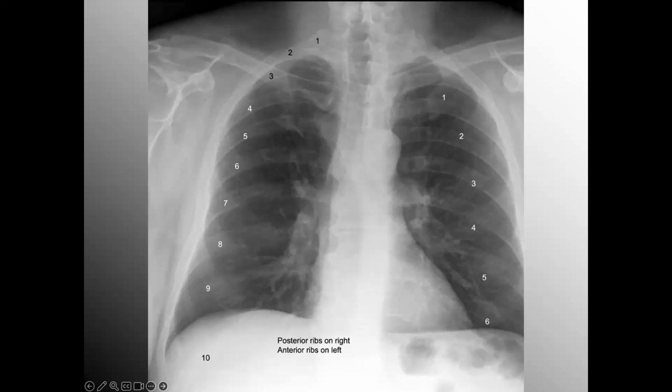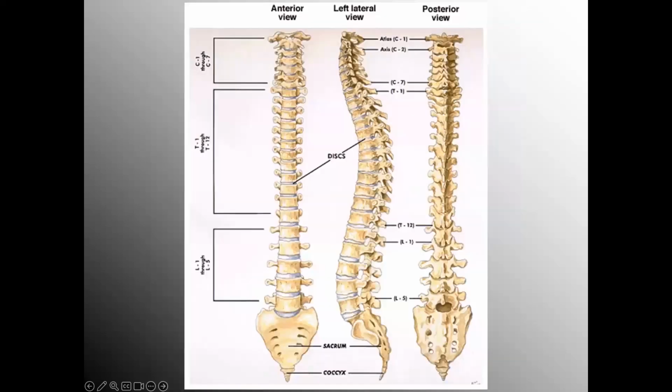And we need to be anatomy experts, at least for the chest wall, because we're looking at chest X-rays, hopefully on the daily or whenever you are working, depending on your area. I know some of you may be doing PFTs or out in the outpatient environment, don't see them as much, and that's okay. So a good clinical nugget here.